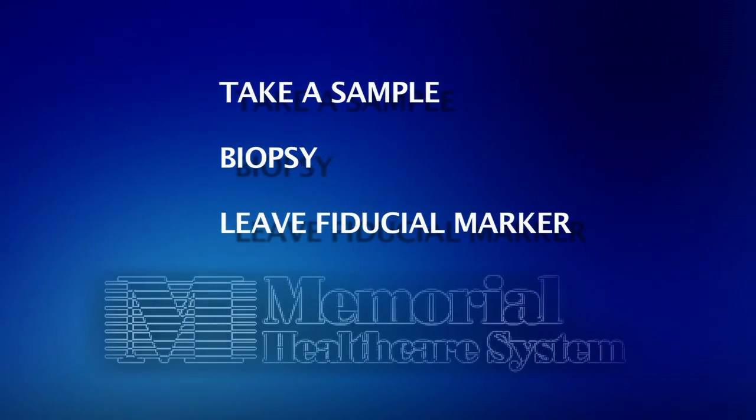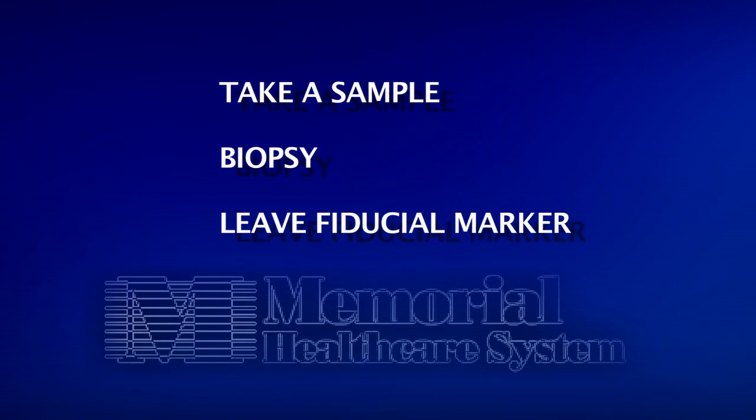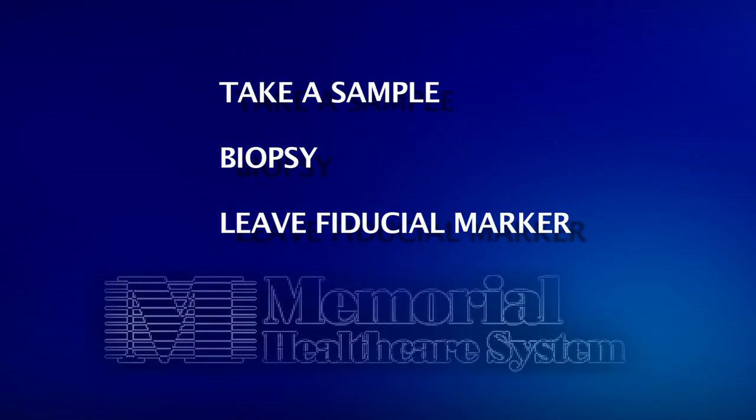And once we're there, we can then do many things like take a sample or do a biopsy, or we can leave a little tiny piece of gold. It's called a fiducial marker that's used to help guide radiation therapy.